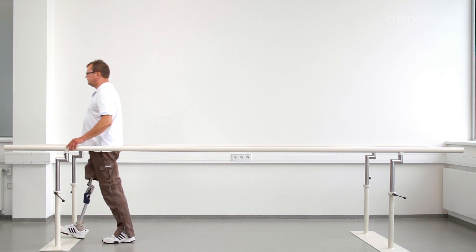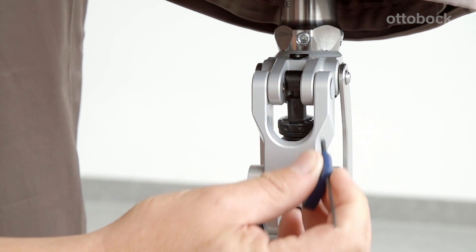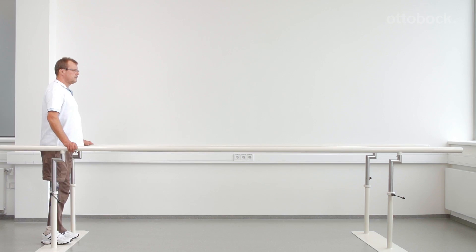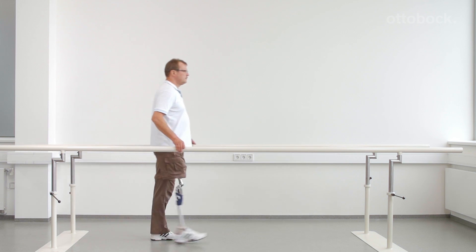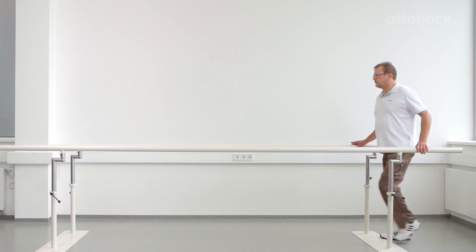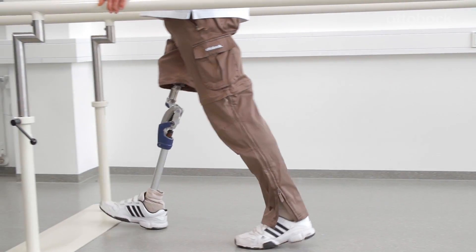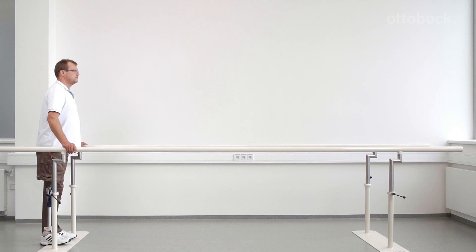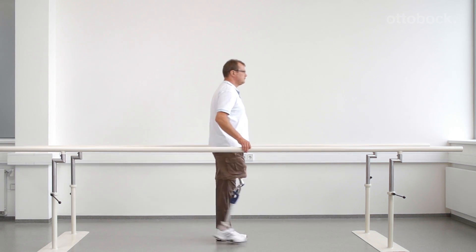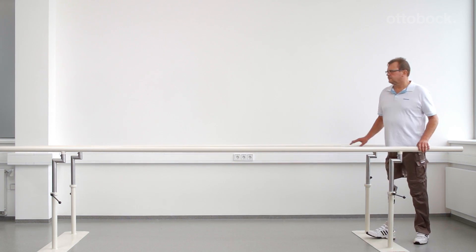This can be an unsafe situation for the user. Now tighten the extension spring slightly and make sure that the prosthetic knee is in full extension when the prosthesis is loaded during heel strike. Once the optimal setting for the user is found, walk at a self-selected walking speed. Walking at different gait speeds is necessary to confirm that the swing phase is set optimally. The settings should be comfortable for the self-selected walking speed and still safe for changes in walking speed.